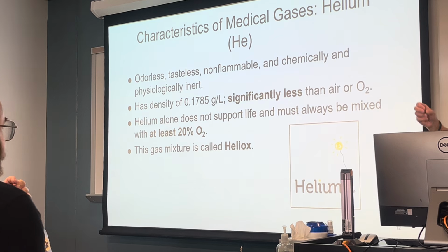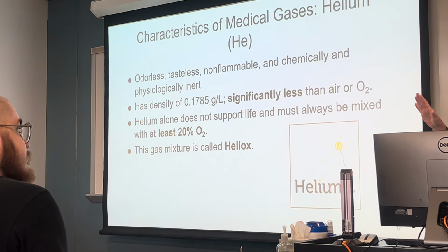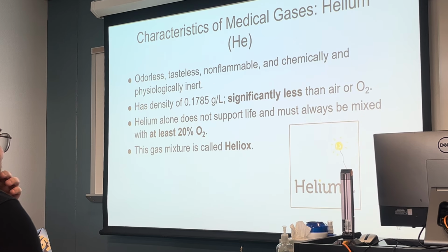Now, when that gas is mixed, we don't use helium in respiratory. We don't use helium, but we do use heliox. Heliox is the mixture, the combination of helium mixed with oxygen, that you will see in the respiratory department.